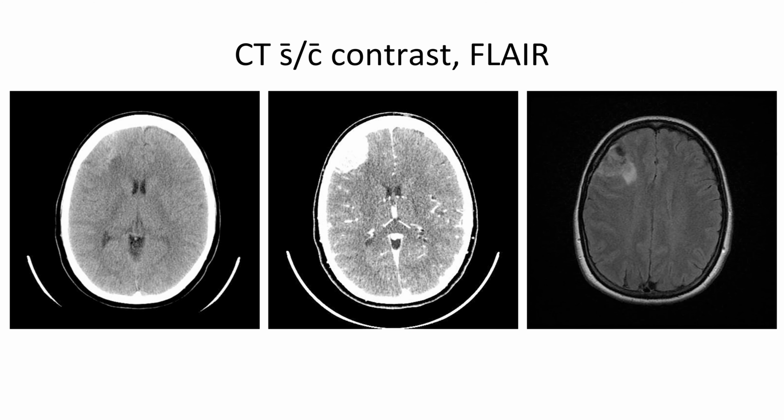This next image shows some CT scans on the left. On the leftmost image you can see what looks like a relatively normal CT scan, but once you look closer, you can see something's not quite right. Now, if we use contrast, as we did in the middle image, you can see something is definitely not right. This was a 55-year-old guy who had his first seizure and unfortunately ended up having a glioblastoma.